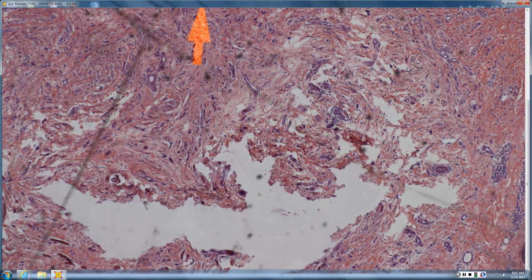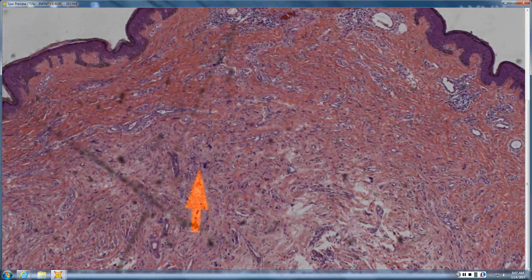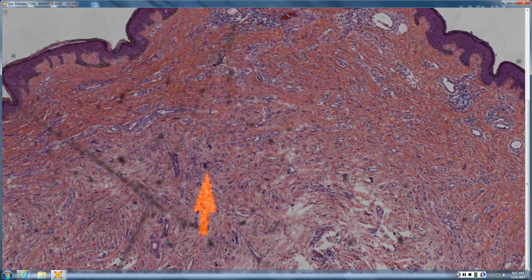And then how about these cells? Do they have one nucleus or multiple nuclei? Multiple. Do you know any kind of multinucleate cell angiohistiocytoma? I think that's it. So multinucleate cell angiohistiocytoma, just very descriptive.